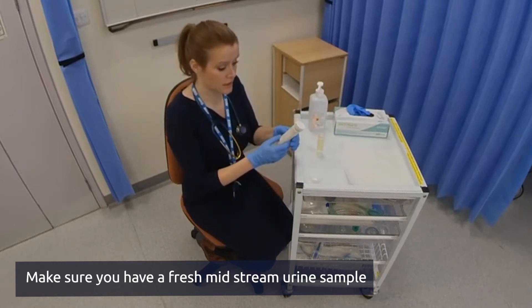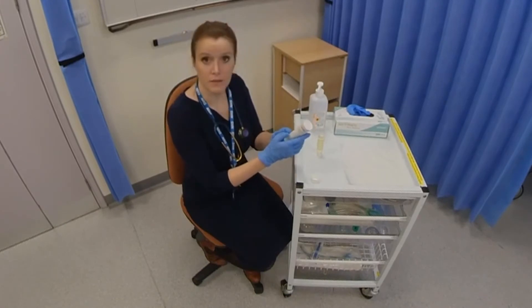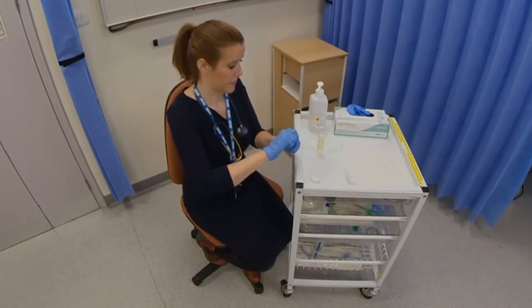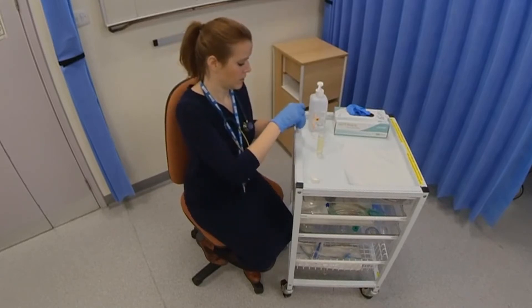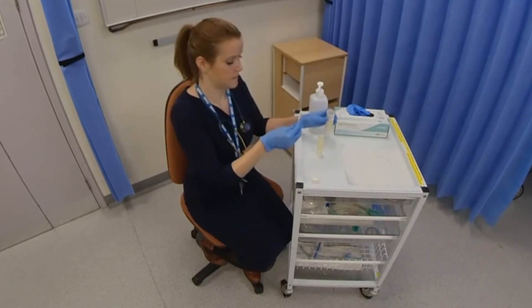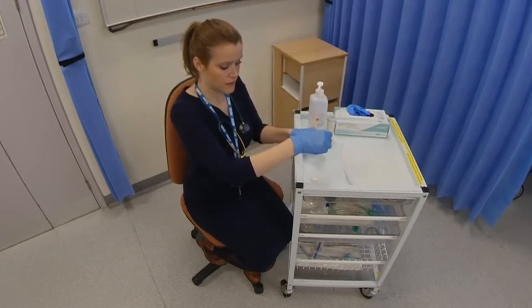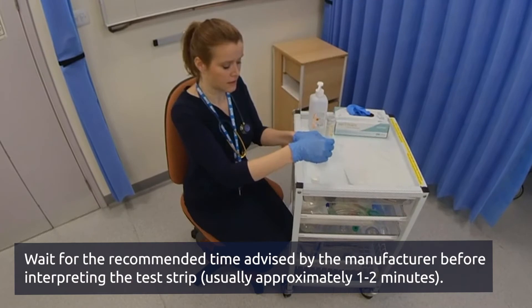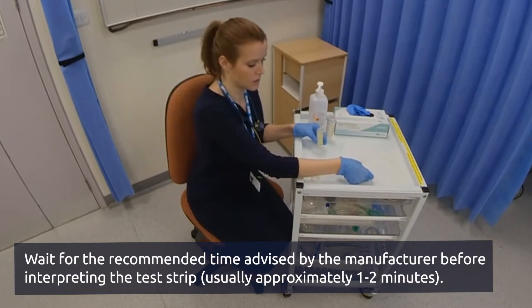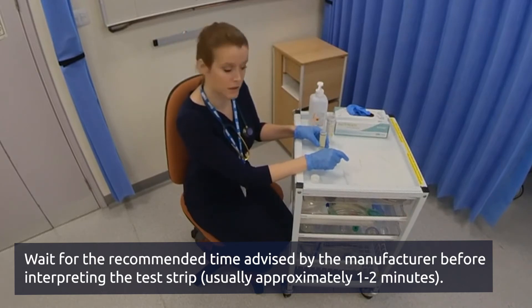You then take your urine dipsticks and first of all you want to check that it is within date. Take one of the sticks and insert it, making sure all of the different coloured squares are into the urine. Just dab off any excess urine and place it down onto the towel. It's important to keep it horizontal so that the squares don't run into each other.